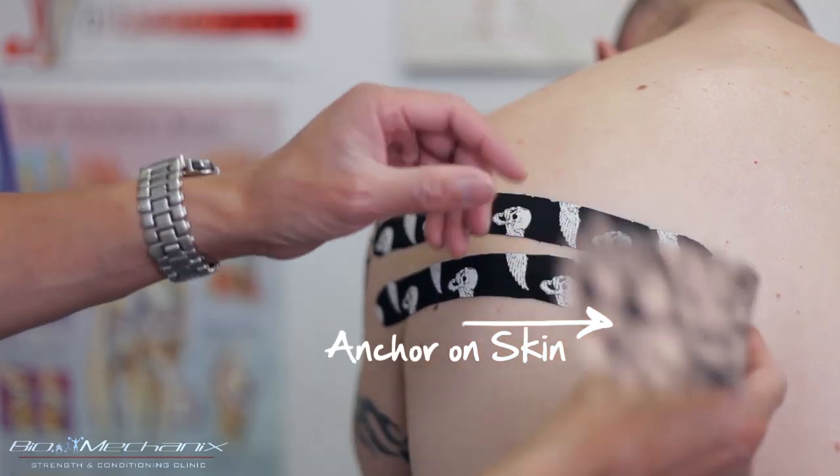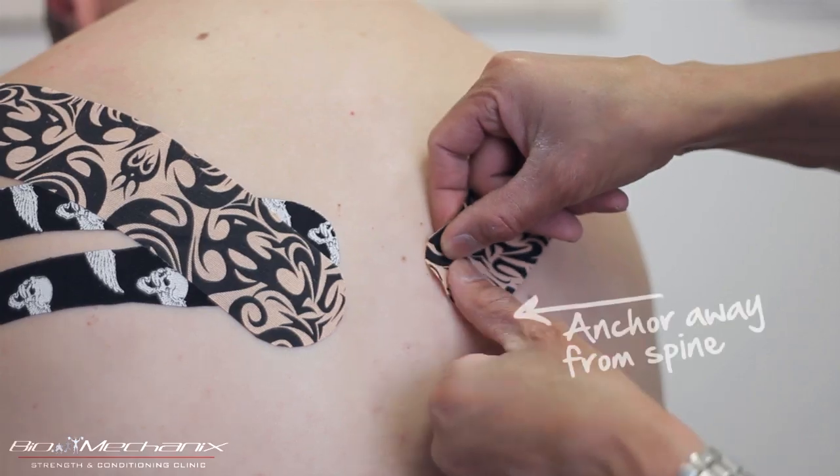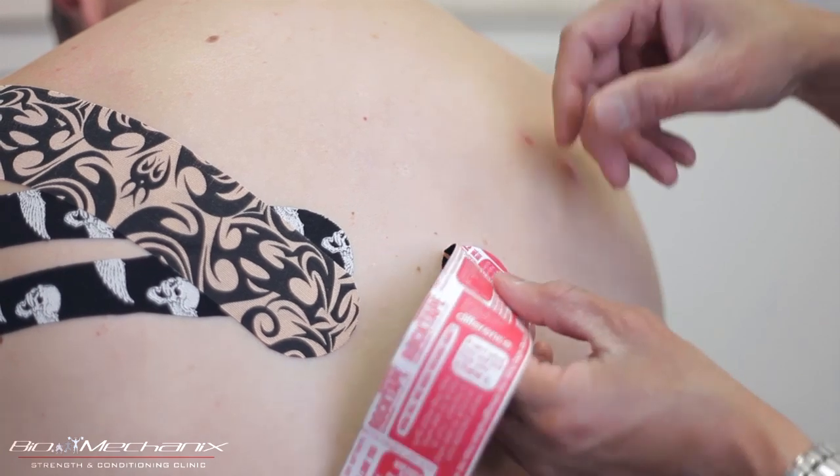When I apply the taping for the rotator cuff, I'm going to have Luke sit in a hunched-over position. This way the skin along his shoulders will be stretched out before I apply the tape.